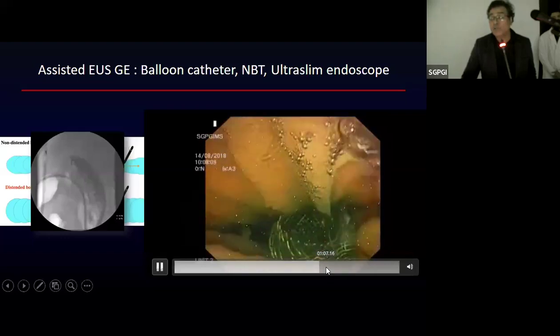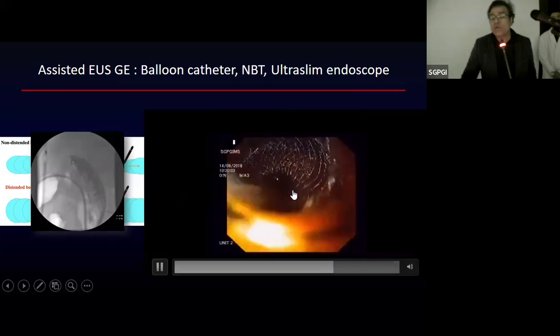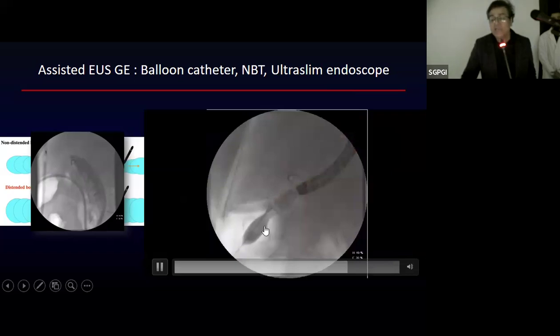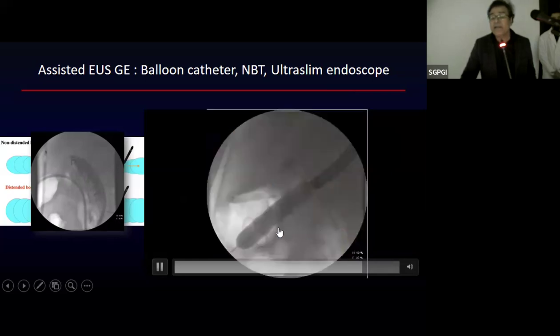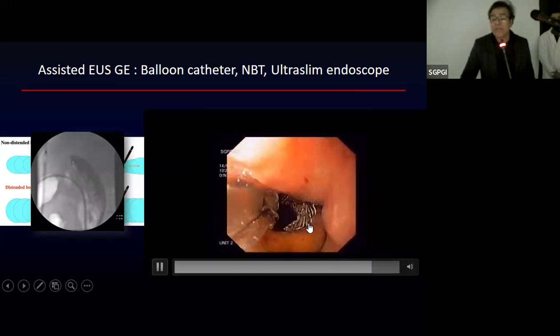However, you need to be sure that the site of the puncture is correct. And then you can go ahead and try to dilate this stent as well. Though the stent opens up within a period of 24 hours, as you can see, this has got flares at the two ends, which are around 27-28 millimeter flare. The diameter of the stent that we use is a 20 millimeter diameter.